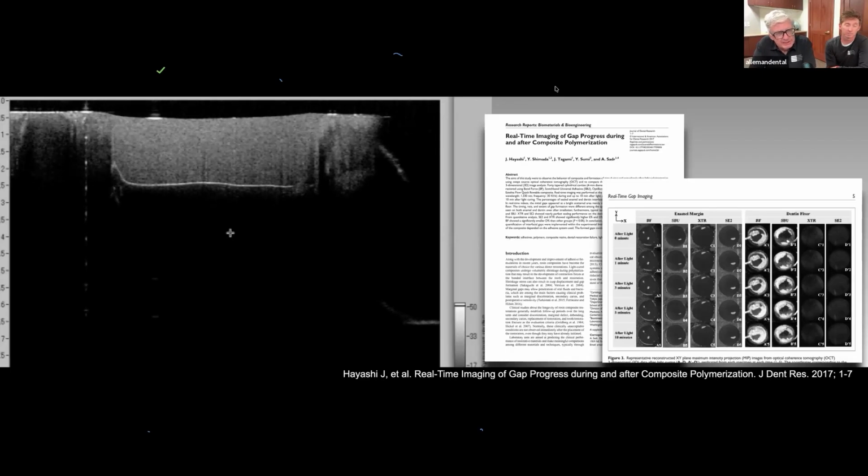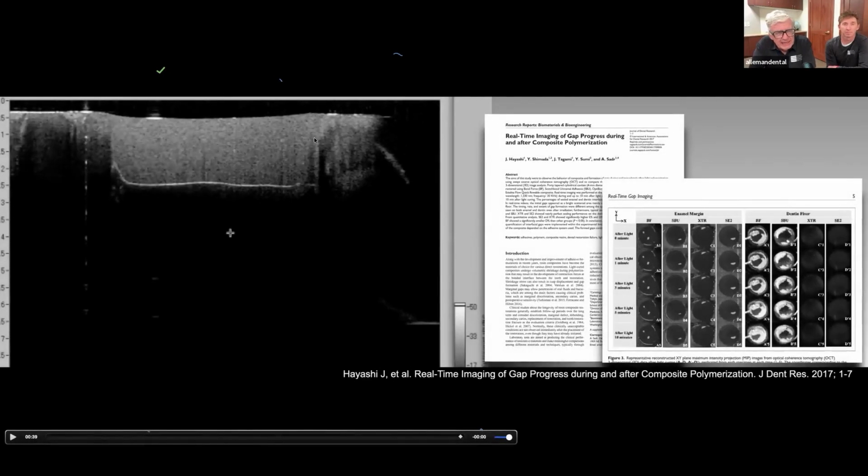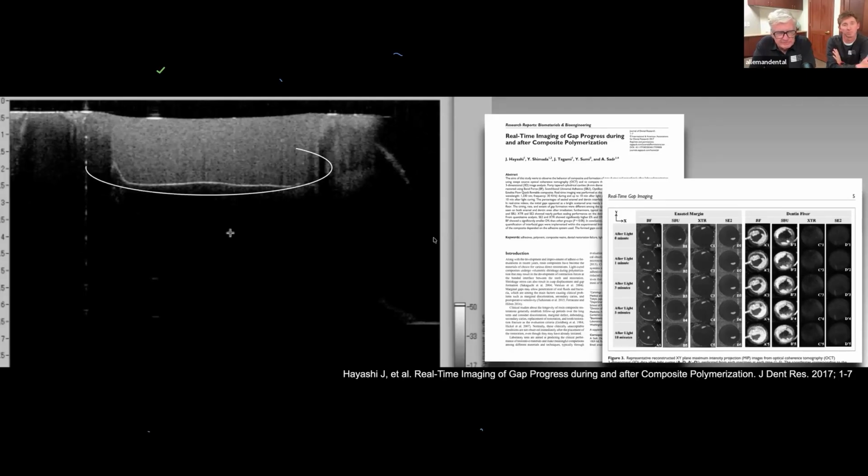this restoration. And that gap that you're seeing right there, see if we can see that. Is that showing up, Davey? That gap is what causes sensitivity and eventual redecay and initiation of cracks. So that's a failure in the future that's guaranteed by the technique of bulk fill with an adhesive that is not a gold standard adhesive.